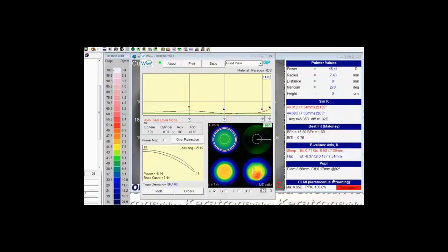We went over what it means to average astigmatism data or not average astigmatism data. We discussed the difference between axial tear layer mode and tangential tear layer mode. If you remember, axial just fits a little bit steeper, a little bit snugger out in the periphery, and tangential will fit a little bit more flat and a little bit looser out in the periphery. They're two different design modes you can choose between. And then we discussed RSIM, GSIM, and freeform: RSIM being rotationally symmetric, GSIM being geometrically symmetric, and freeform being completely asymmetric, and when you might want to use those on different lens designs.